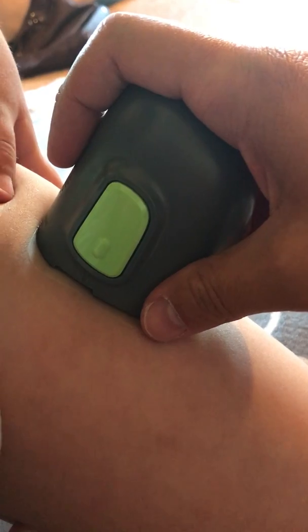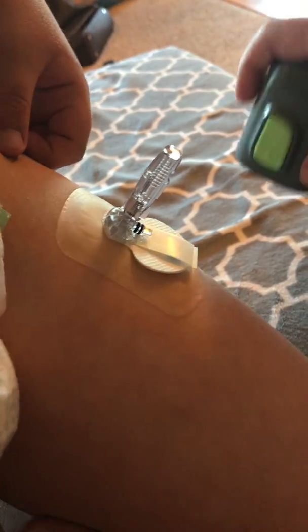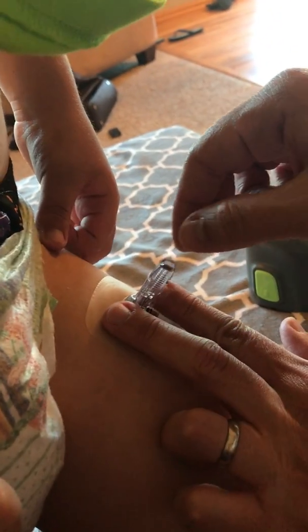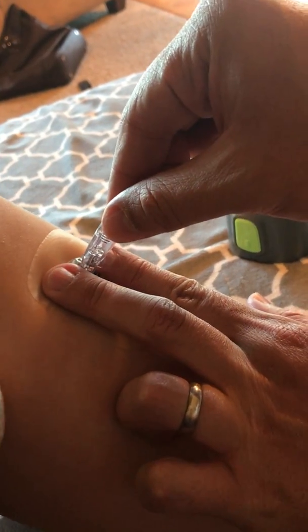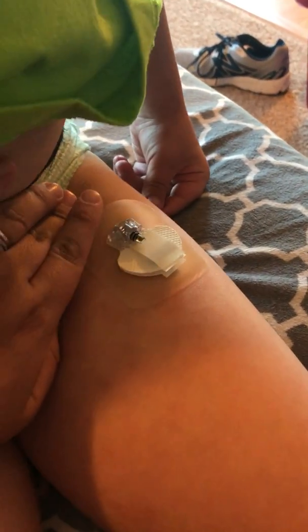Awesome. You're doing awesome. It does hurt him. Then you pull it straight off like this, and then hold down on this plastic part, and then the long part sticking out, you pull out. And then it's in there. He's being very brave right now for this video.